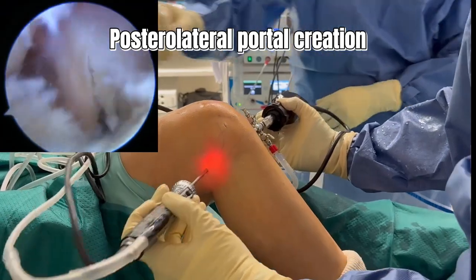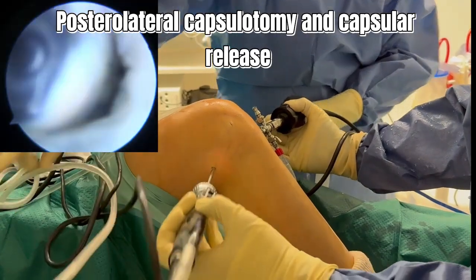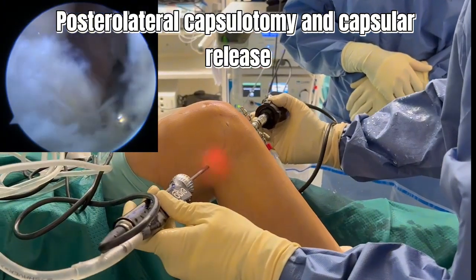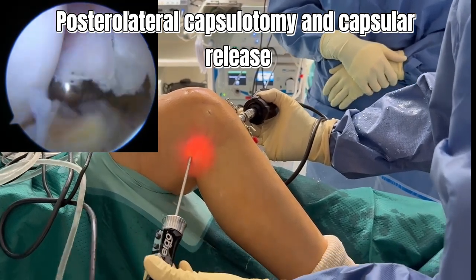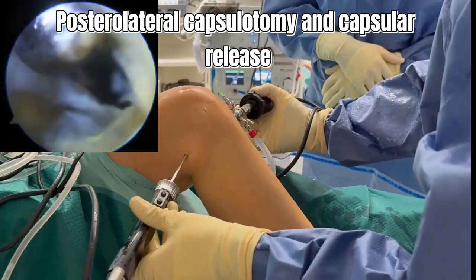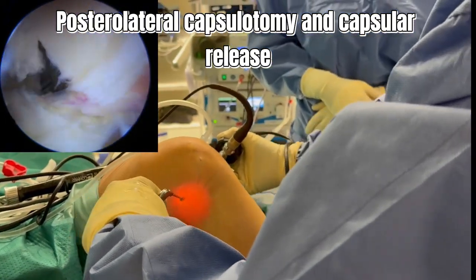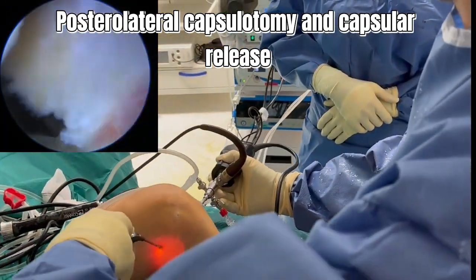With the arthroscope remaining in the posteromedial portal, the motorized shaver introduced through the posterolateral portal continues to remove any residual septal tissue, fully exposing the posterolateral capsule. Similar to the posteromedial side, an initial capsular breach is created at the spinal needle insertion site at the most lateral part of the capsule using the shaver. The basket forceps then complete the capsulotomy and capsular release inferiorly and medially along the tibial plateau until the gastrocnemius muscle fibers are clearly visualized.